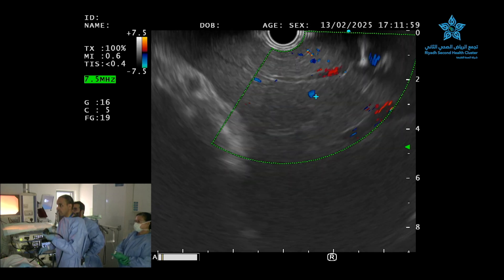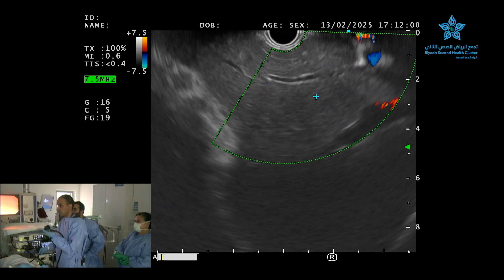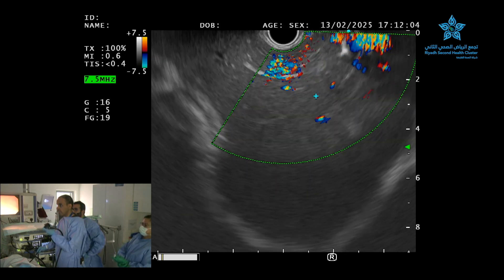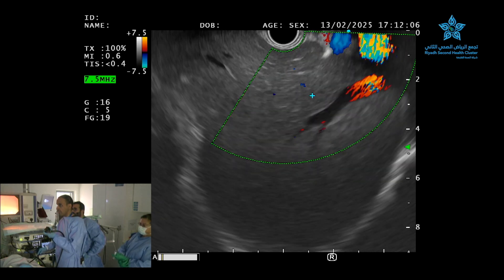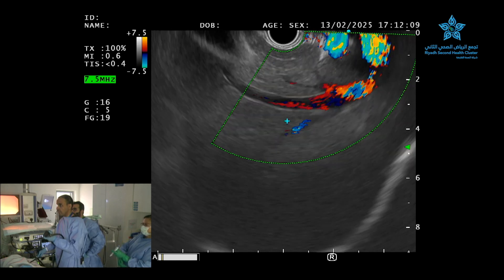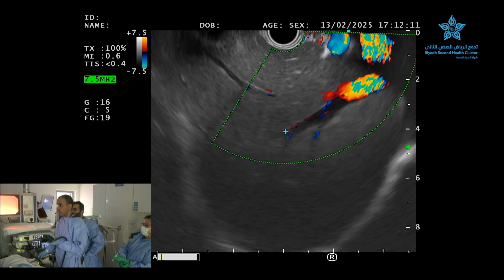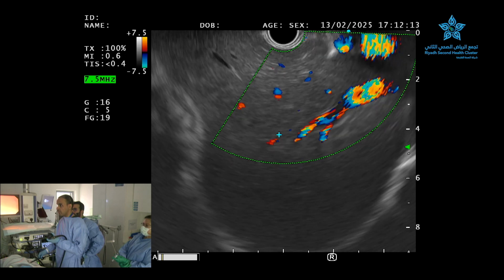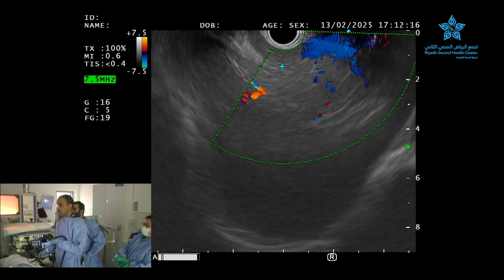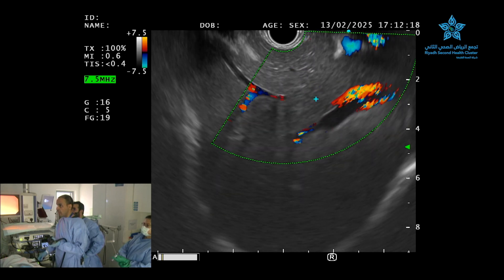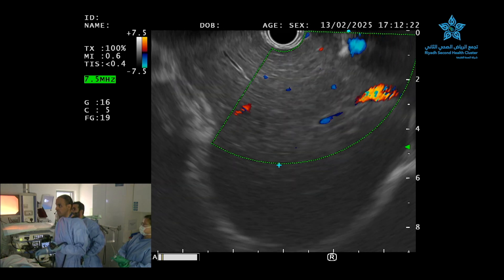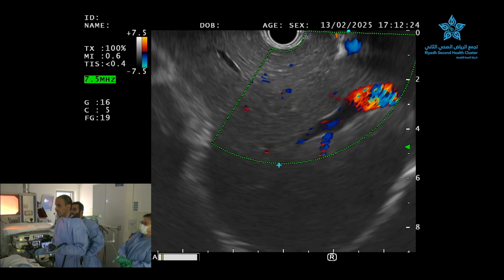During the examination, Nawaf will find the best place to insert a needle. This area looks good — avoiding the vasculature will be here. Going more counterclockwise — yes, that's a good area. We need at least three centimeters of distance where we can put the needle and get a good core biopsy.